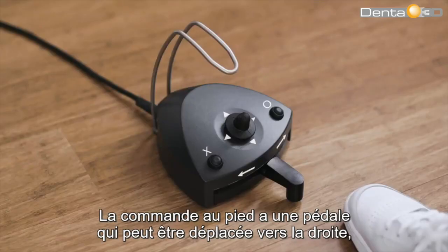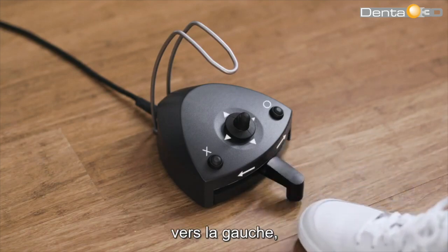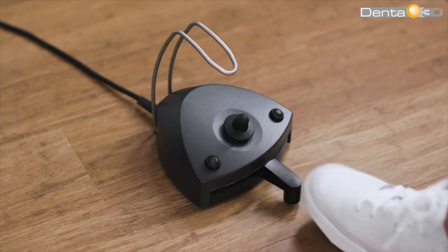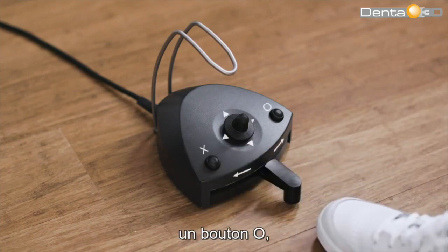The foot control has a pedal that can be moved to the right, to the left, or pressed down. It also has an X button and an O button.